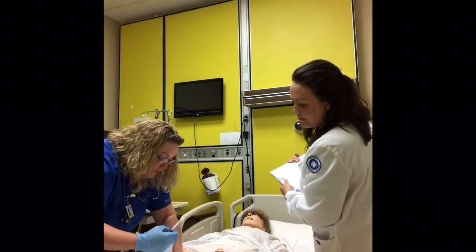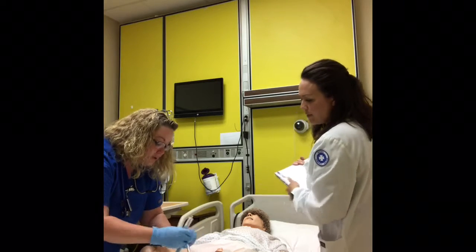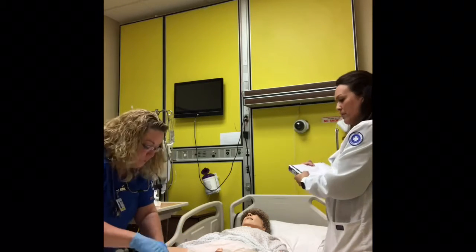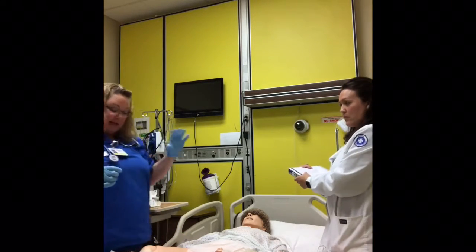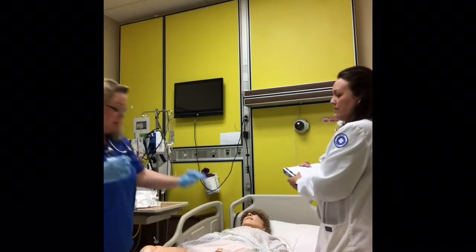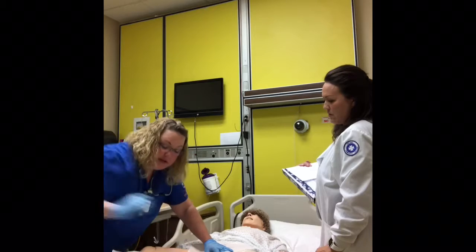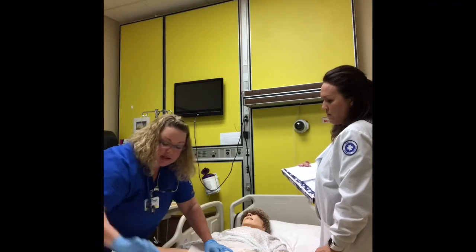So everything's sterile here. I'm going to connect to the tubing. There we go. Okay, so I've explained the procedure to the patient. I'm taking my iodine. Now this hand is going to be dirty, so I'm going to hold the patient here. I've got the iodine. Do outside, toss, iodine, outside, toss, iodine.